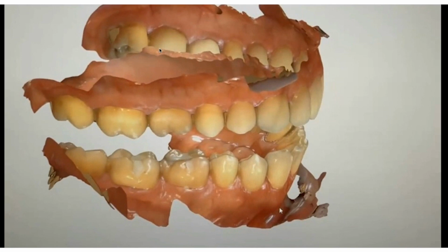Also, if you want to know how to do the bite using the Som gauge, the reason why I like the Som gauge is because I can change the verticals. I can do 4 millimeters or I can do 8 millimeters. It's not very common to have to raise the vertical. Most of the time you minimize it. But in men with scalloped tongues, and we do something called a snore test, sometimes increased vertical really does help.